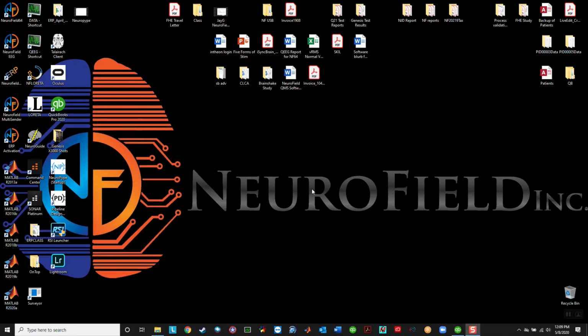Hi, I'm Dr. Nicholas Dogris, and I'm going to show you how to use what we call RTZ, or real-time Z-score, using synchronized EEG neurofeedback and neuromodulation techniques, utilizing pulse electromagnetic stimulation and transcranial alternating current stimulation.